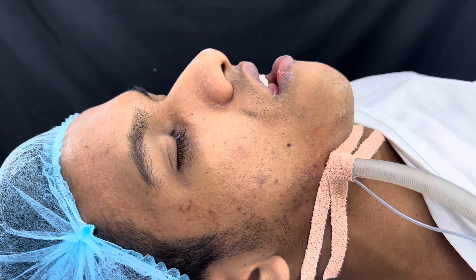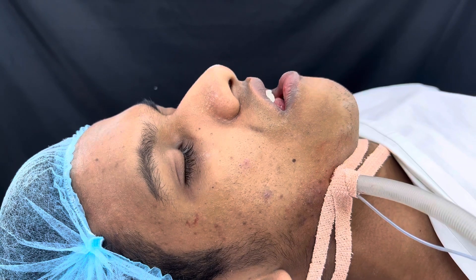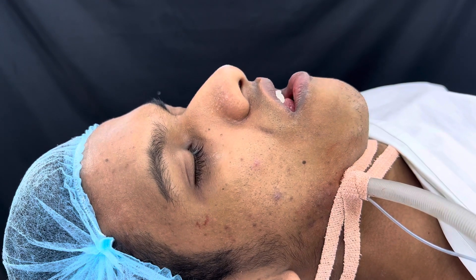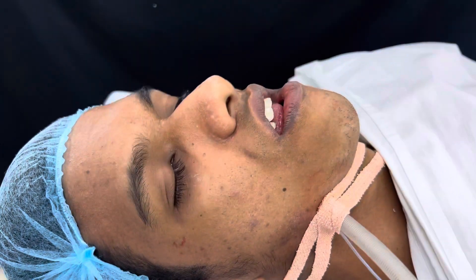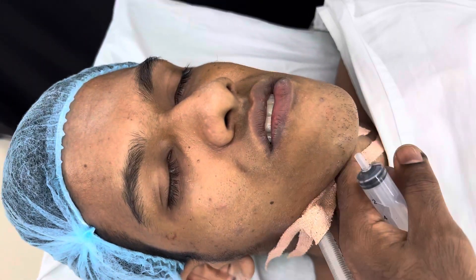We're about to start a bimaxillary surgery here — it's a face makeover. We're getting the upper jaw forwards, rotating it a bit downwards in a clockwise movement. This is the patient's occlusion and this is how the patient looks before we start.